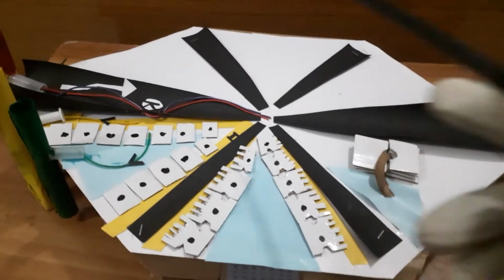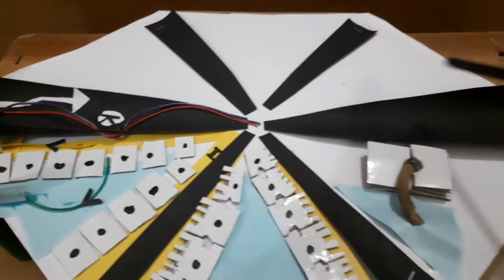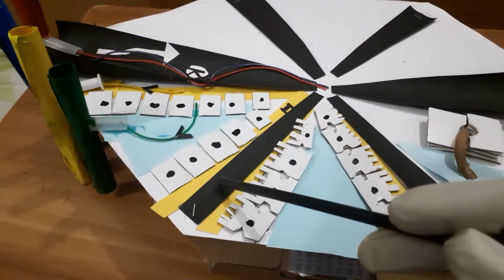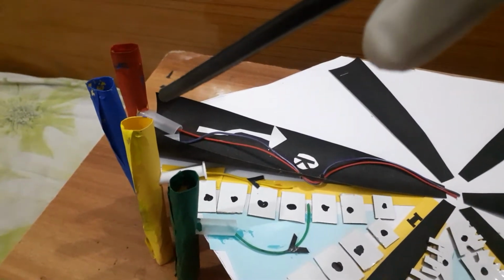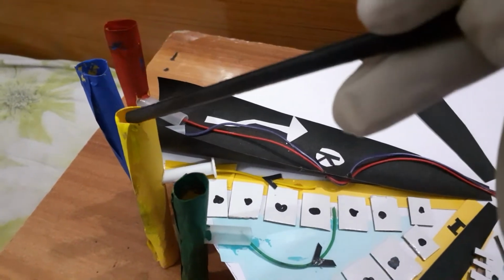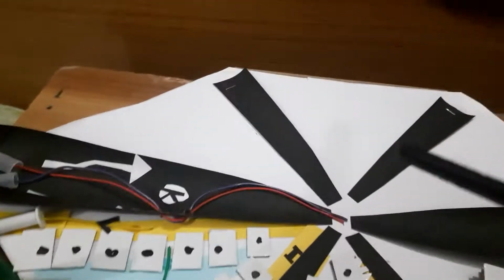This is one classic hepatic lobule. This black one is the sinusoids. These are all sinusoids. And this is the portal tetrad. This is hepatic artery, this is portal vein, this is lymphatic system, and this is bile duct in green color.